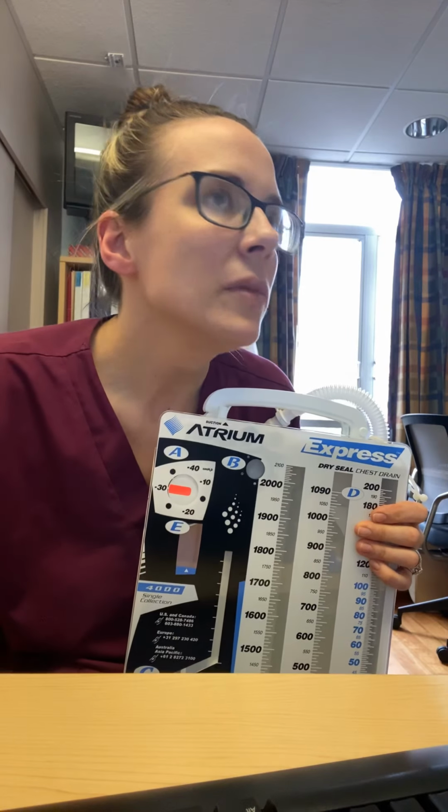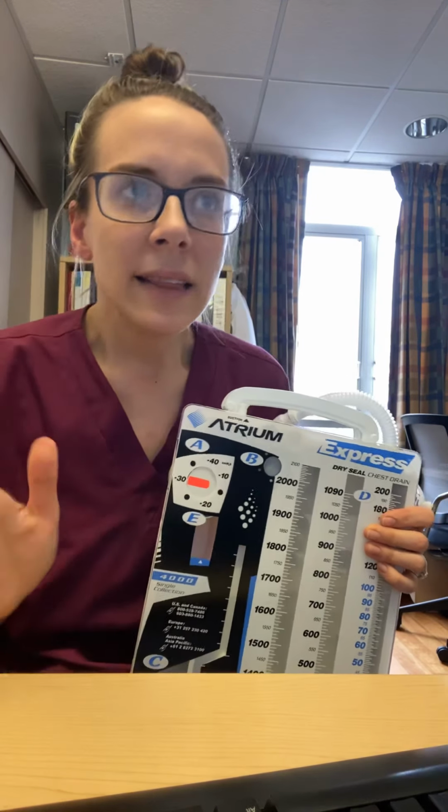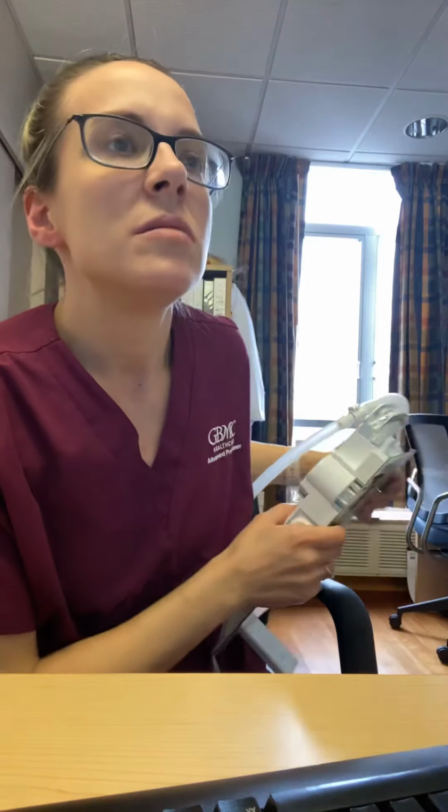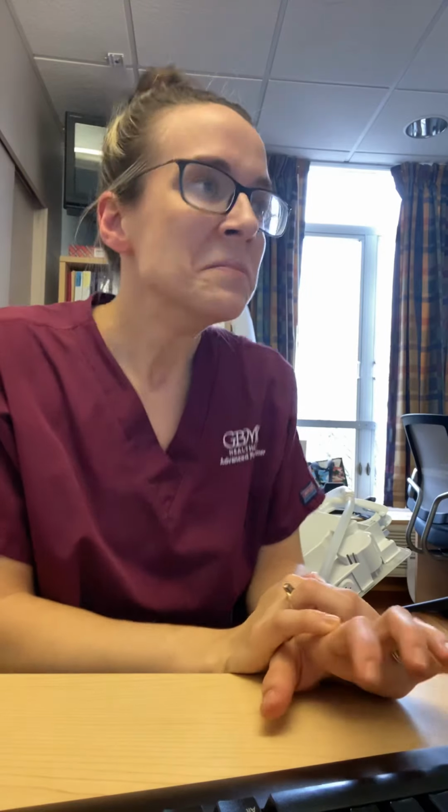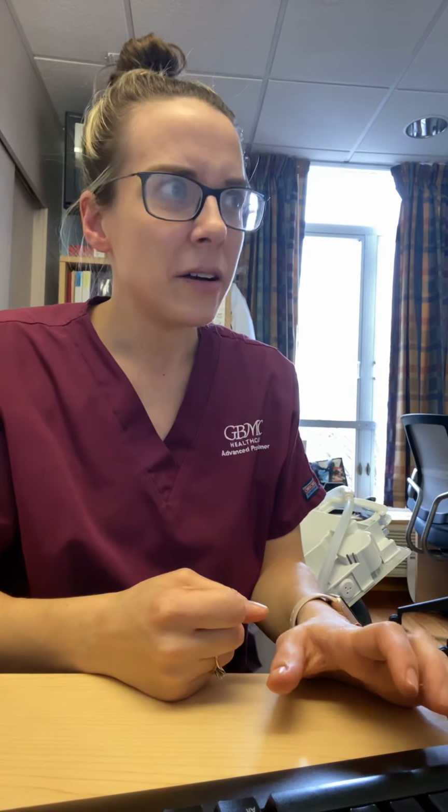Okay, next slide. I like this schematic because it really shows visually what an air leak is. Again, I told you that lung parenchyma, for whatever reason, is leaking air, most commonly following a wedge or a lobe resection where you're stapling across lung tissue and air is escaping surrounding the staple line. So you can see the tip of the chest tube is in the pleural space to collect that air.